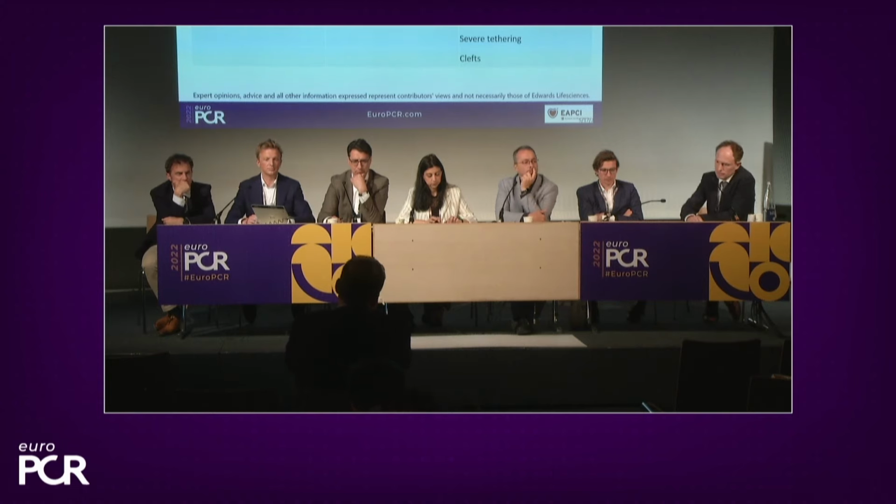Yeah, actually, the strategy for flail is always to directly place your device in the flail, which I would say works in 80% of the degenerative cases. In this case, we placed it in this lateral position, P1, P2, but we had a large central jet coming up. So that's why we decided to place the first device more medial to treat this more medial regurgitation and to adapt the leaflet, and then we could place the second device lateral, which is the usual strategy, to go with the first device medial and the second device lateral, which is a little bit easier in the mitral valve anatomy.